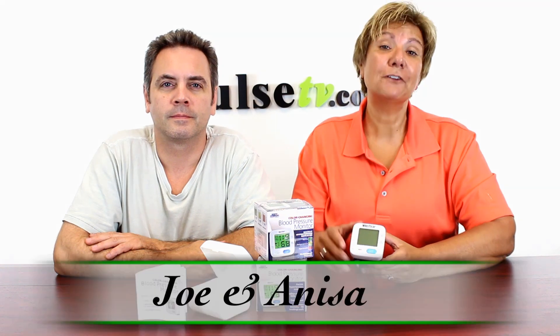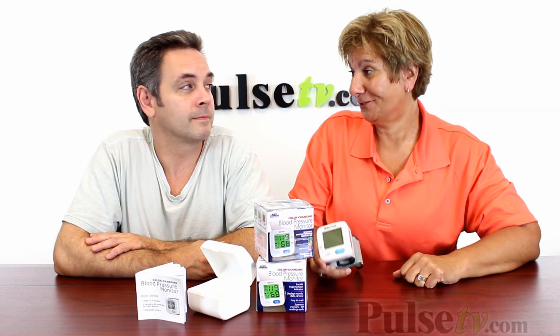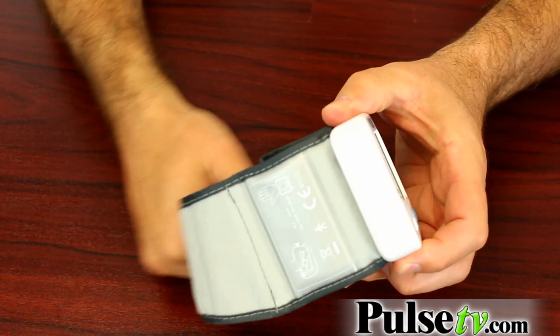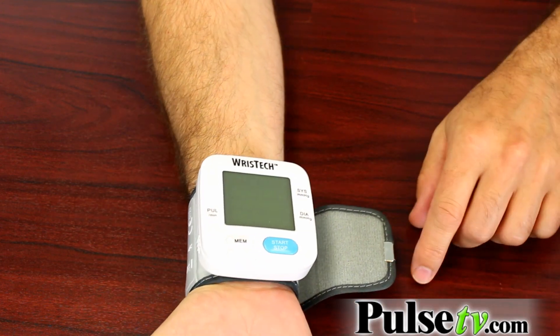Hey, it's Anissa and Joe, and we have for you today the easiest blood pressure monitor you're ever going to use. That's probably true. It really only has two buttons — one button is to save your readings and the other is the start button. So you just slip it on your wrist, press the start button, and the automatic device takes care of everything else.